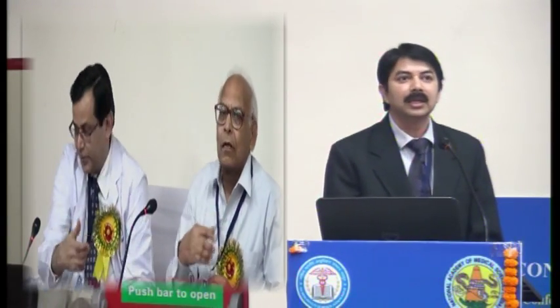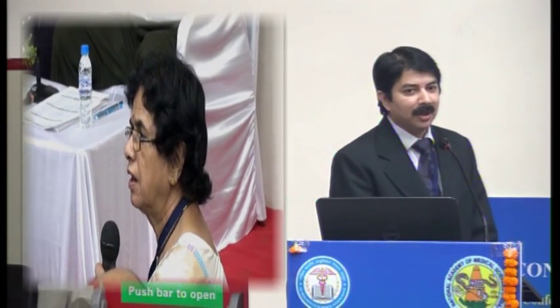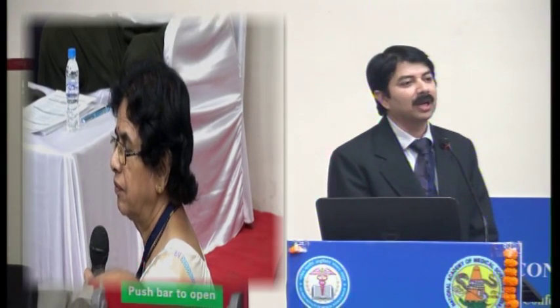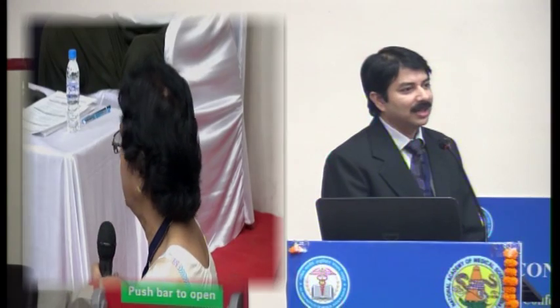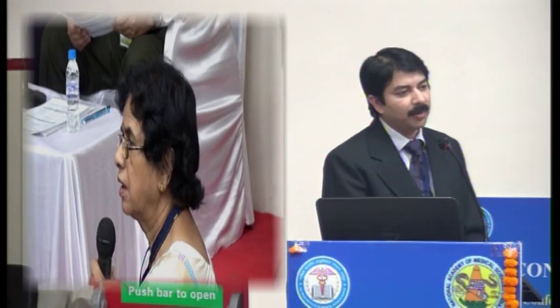Ma'am, fortunately with the government's efforts and sir's efforts, we are getting these machines very soon. We are getting 3 machines. High-end linear accelerators, I didn't want to mention because it's all in the pipeline, but we'll be getting the high-end machines which are already sanctioned, along with the HDR brachytherapy and CT simulation.